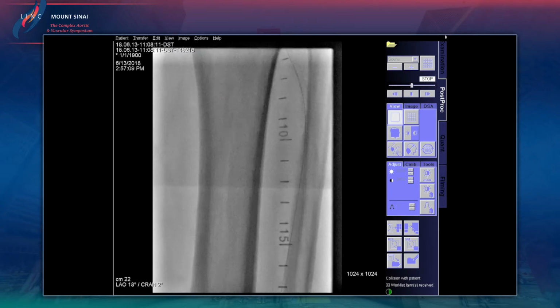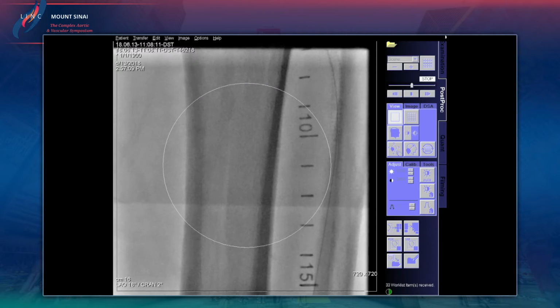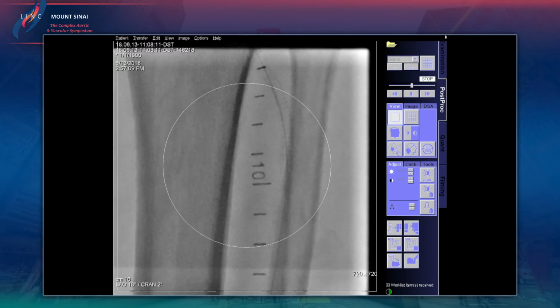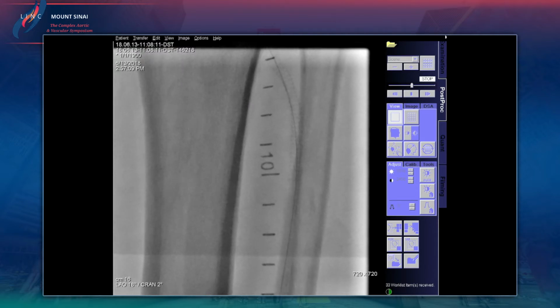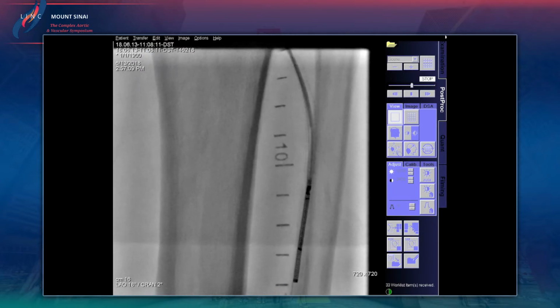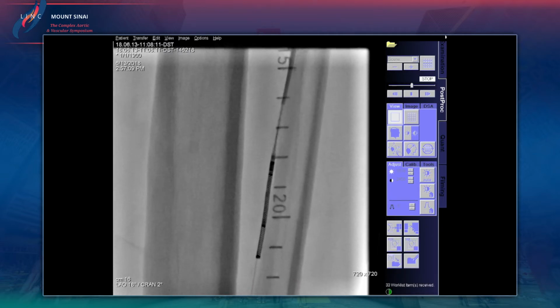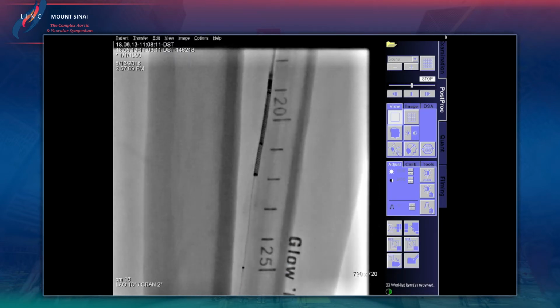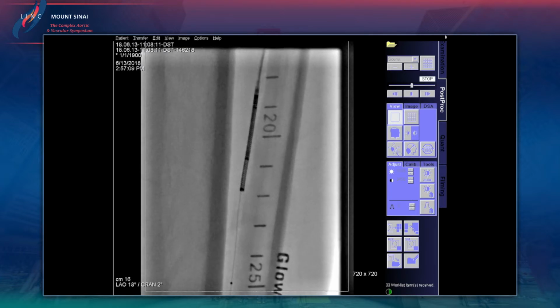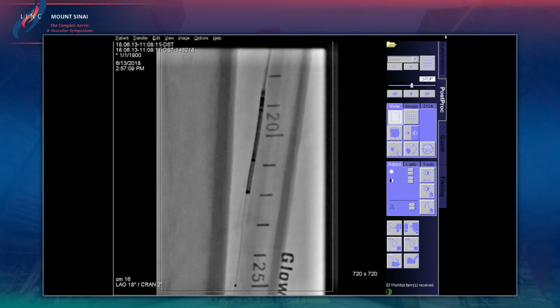Show me down. Down. No, this is good. The interesting thing is, even though stenting is really not in favor for a lot of people, the data really shows that that's the best thing we really have in terms of what is durable. I know that the restenosis always occurs proximal and distal to the stent, but if you look at what we're able to get out of it, it's really surprising.